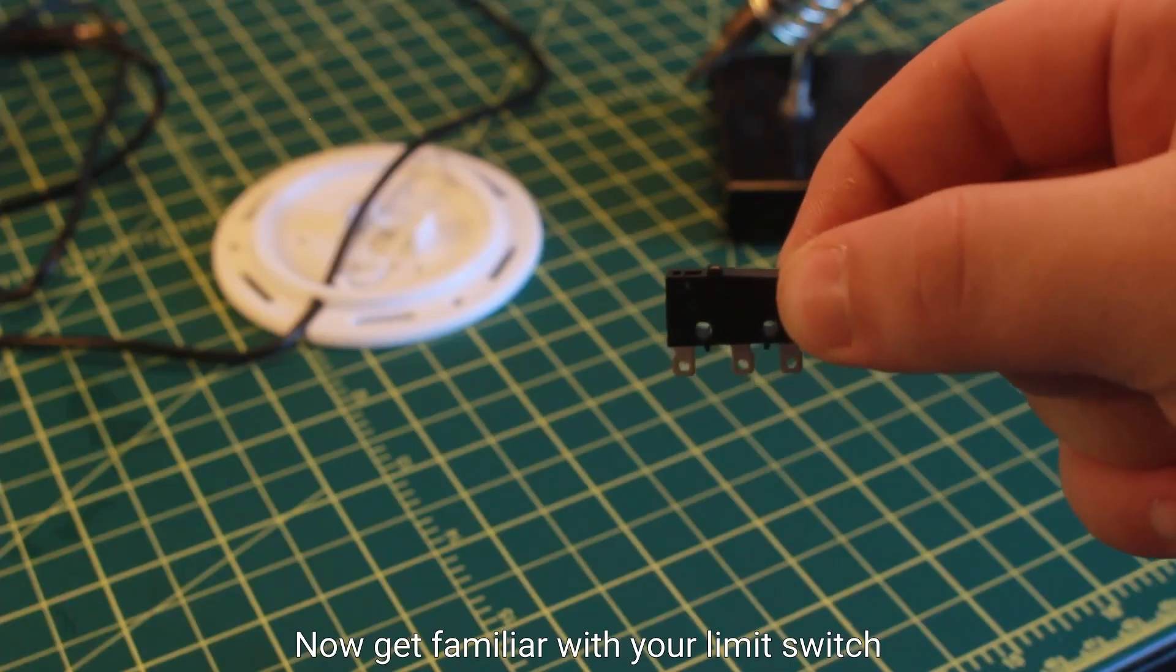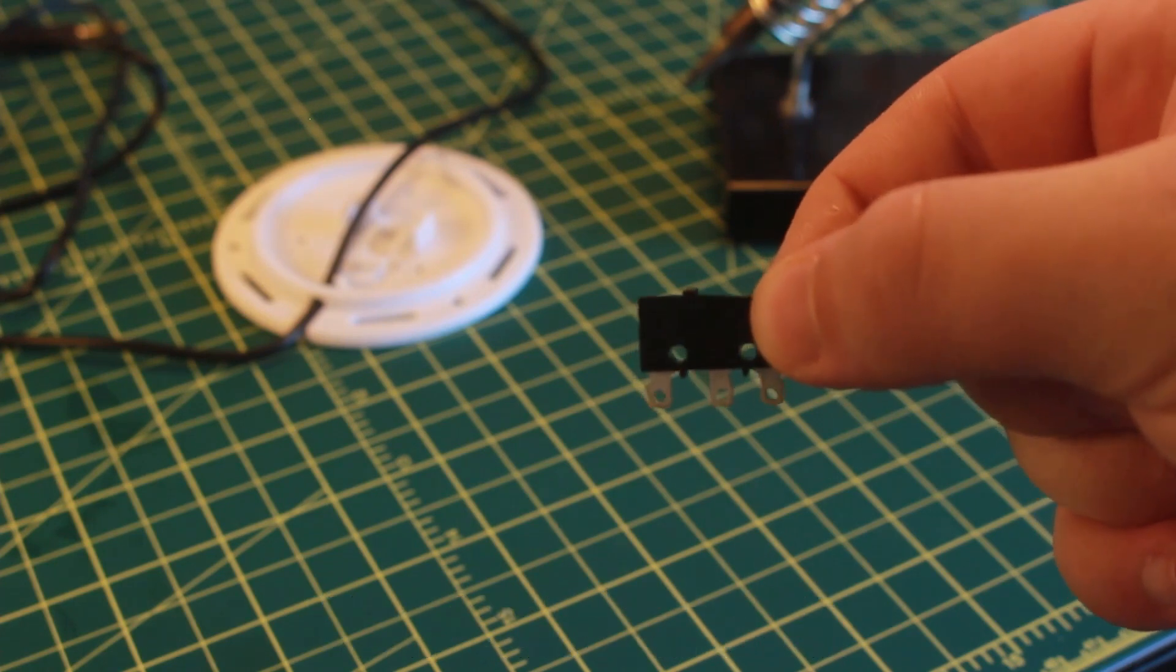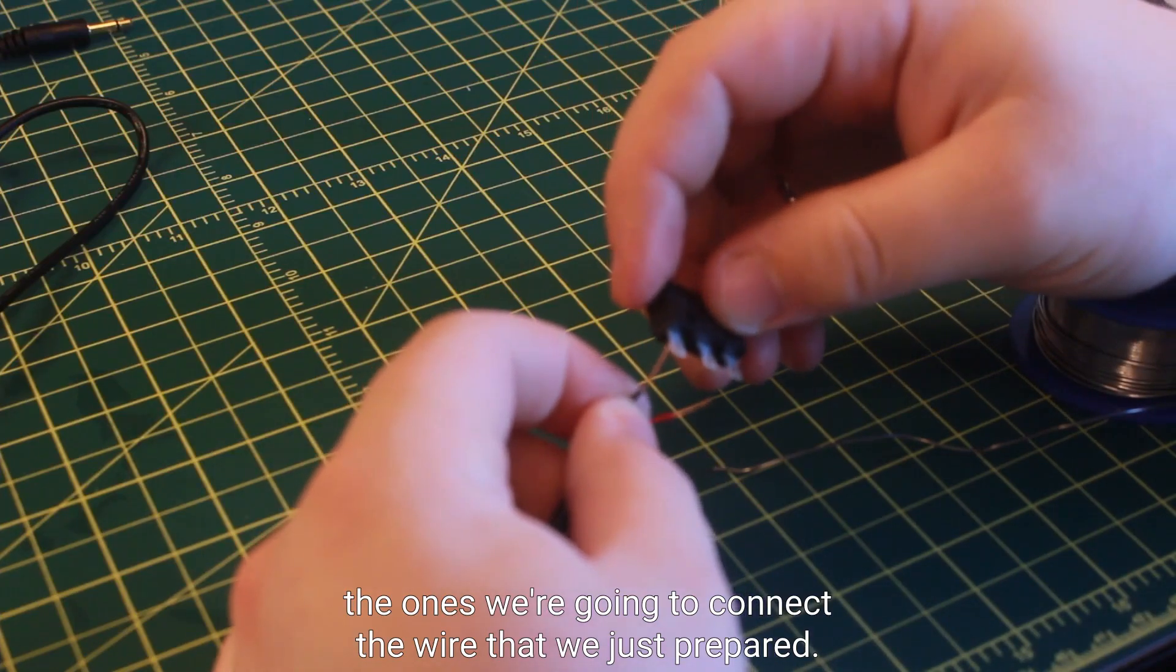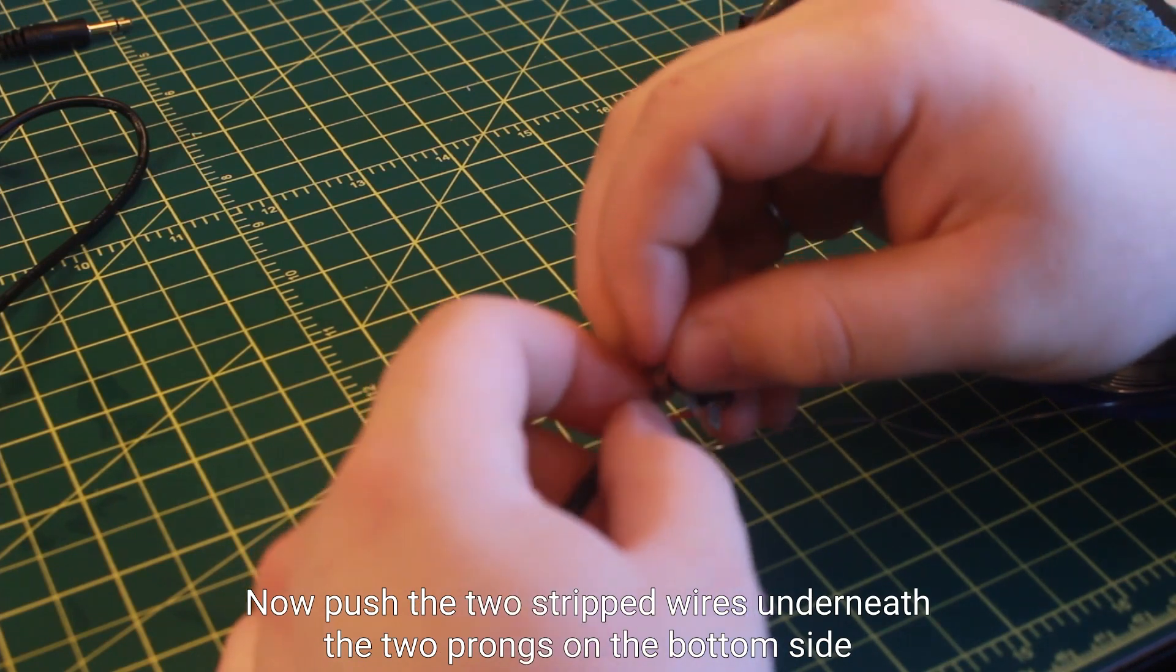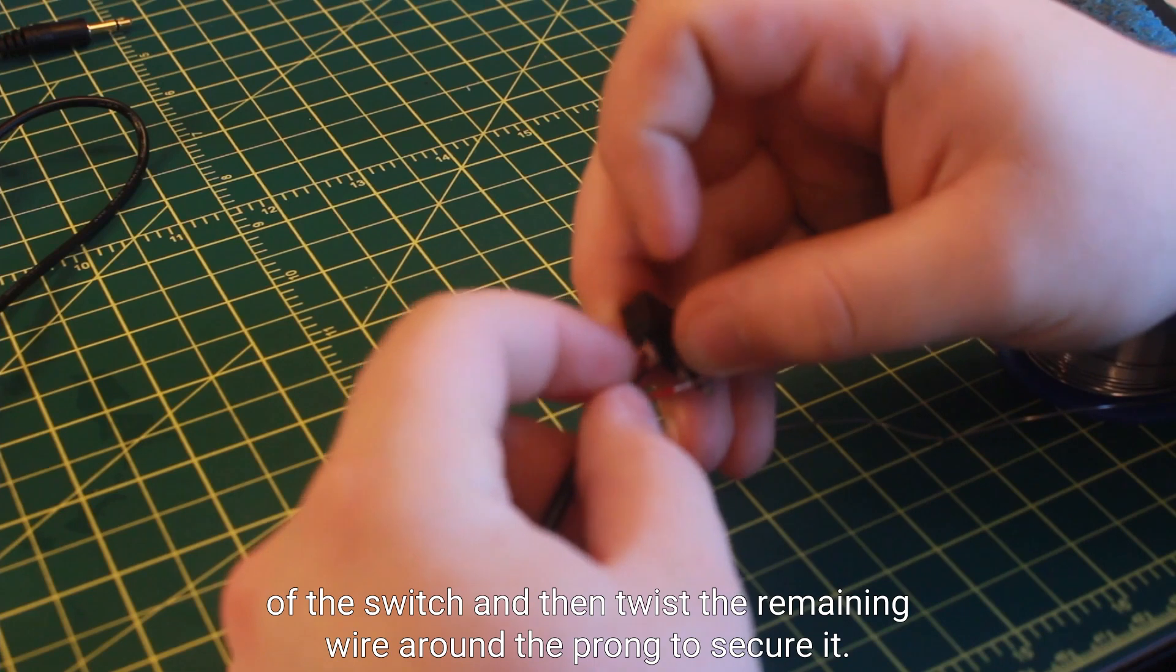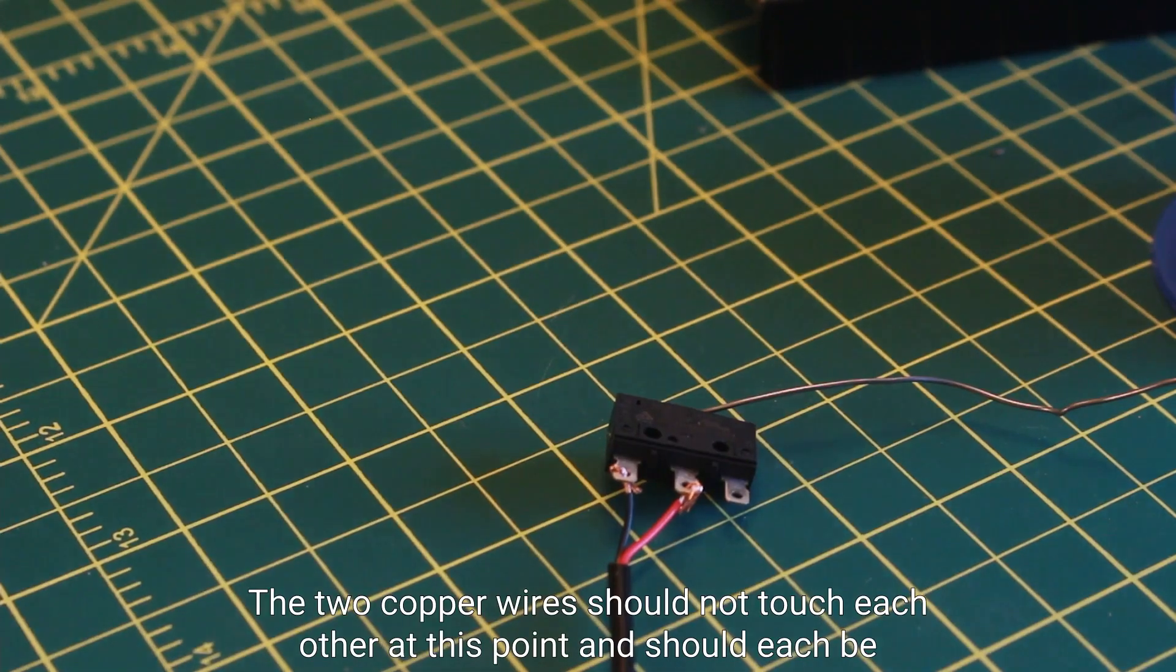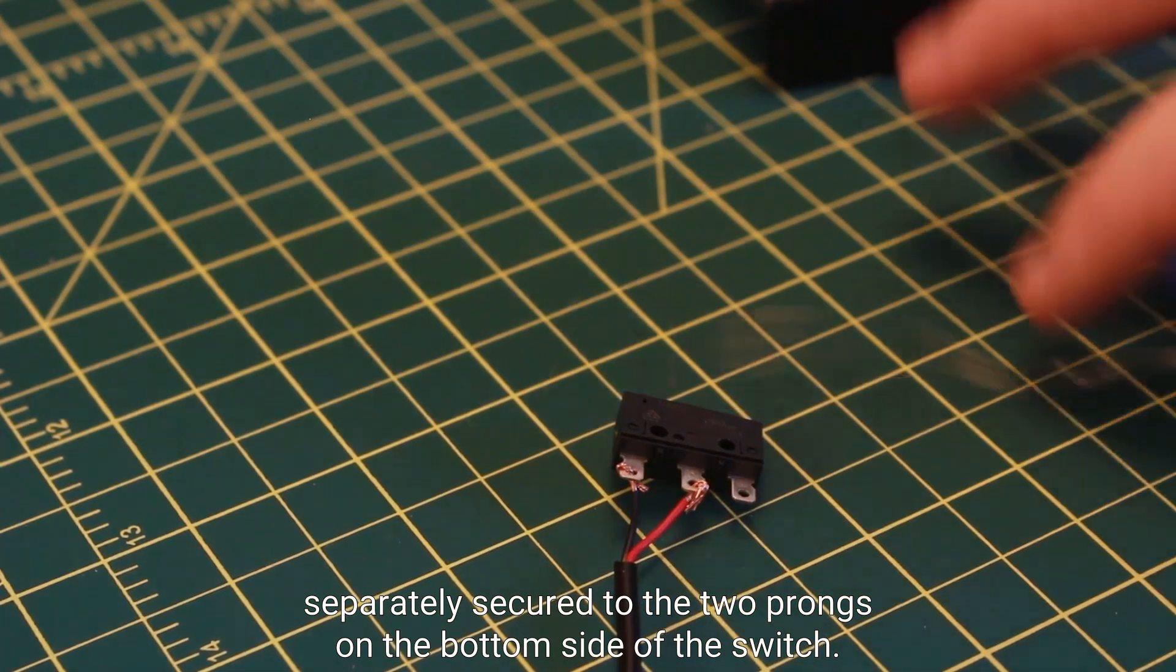Now get familiar with your limit switch and notice that the button on the top is closer to one side than the other. That's the side that we want to work on. The two prongs underneath that button are the ones we're going to connect the wire that we just prepared. Now push the two stripped wires underneath the two prongs on the button side of the switch and then twist the remaining wire around the prong to secure it. The two copper wires should not touch each other at this point and should each be separately secured to the two prongs on the button side of the switch.